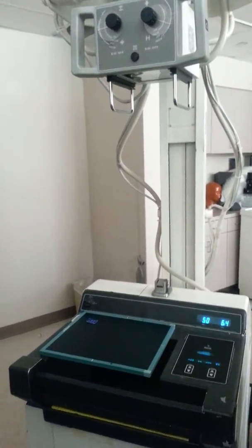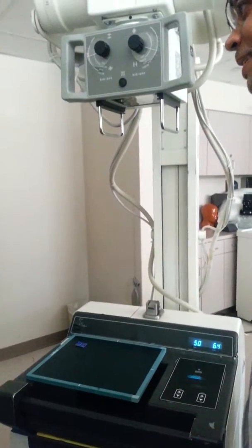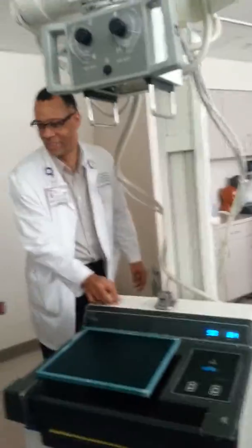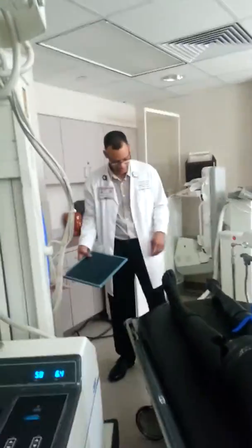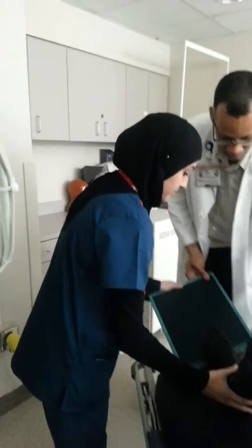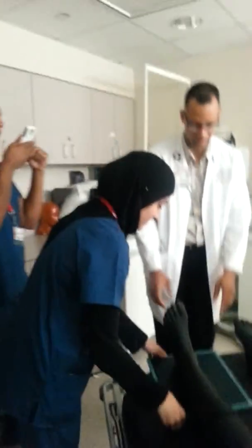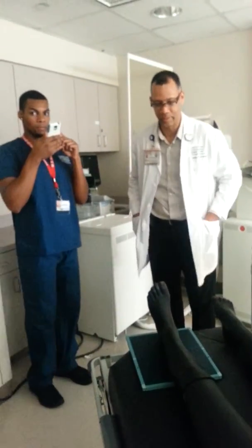Allow one of the students to give an example of an X-ray on the foot. Are you ready? Anybody want to? You can't bend the knee all the way, so just say ankle. We're going to do the ankle. Okay, ankle X-ray, just an X-ray of the ankle here. And that's what my letter marker is, right here.